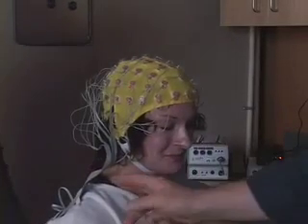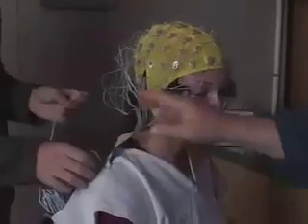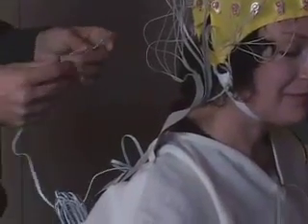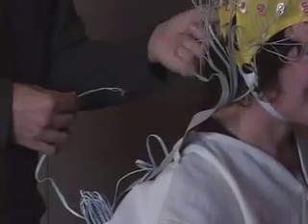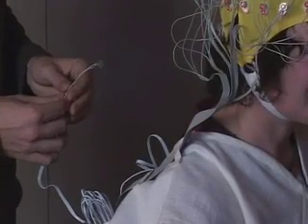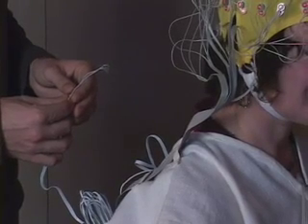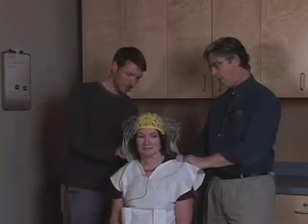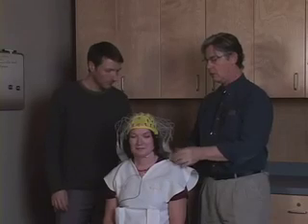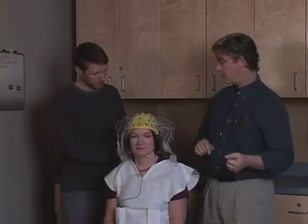And we'll notice that the vest that we have here makes sure that there is no pressure being placed on the wires themselves. What it does is it ensures that there's no extraneous movement due to gravity on the electrodes, and to ensure that we get as good a recording as possible. You'll notice that we have the ribbon cables secured by the vest in order to not place any weight on the wires pulling the electrodes.